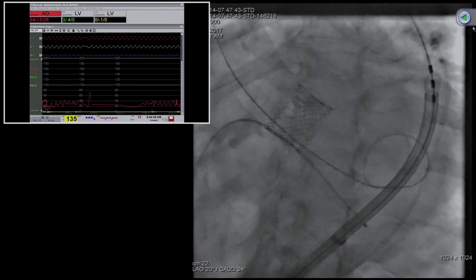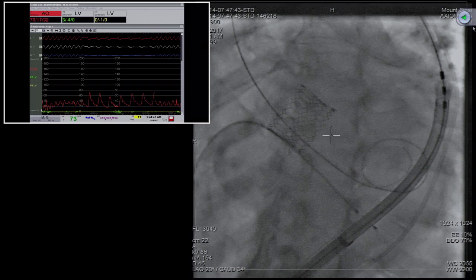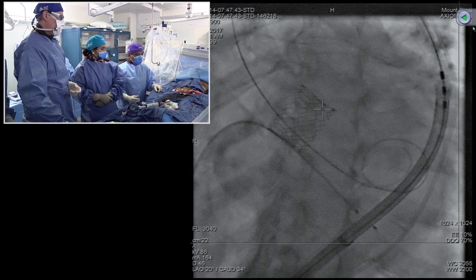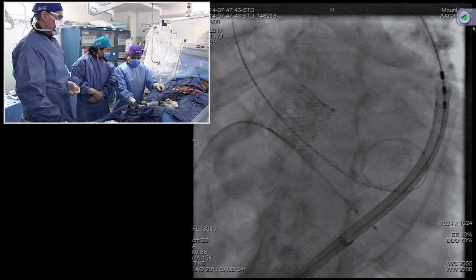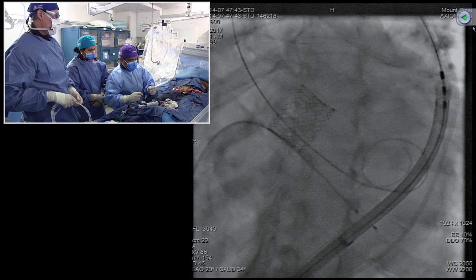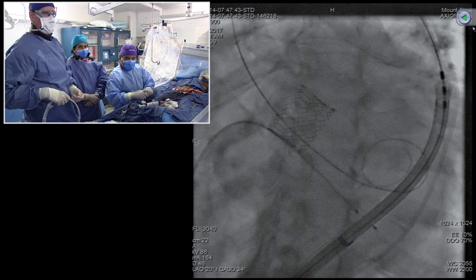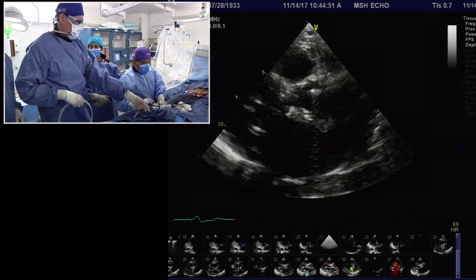Very good. Blood pressure up again. Pressure is good. Very good. I think you should remove the equipment anyhow. We are done here. We're not going to dilate anymore. I think echo will decide. If echo shows nothing, we are not going to do aortogram because of the high creatinine. I will probably do the aortogram because you have the issue of the porcelain aorta. Make sure you did not create any other thing. One final aortogram would be good. And the viewers would like to see an aortogram as well.